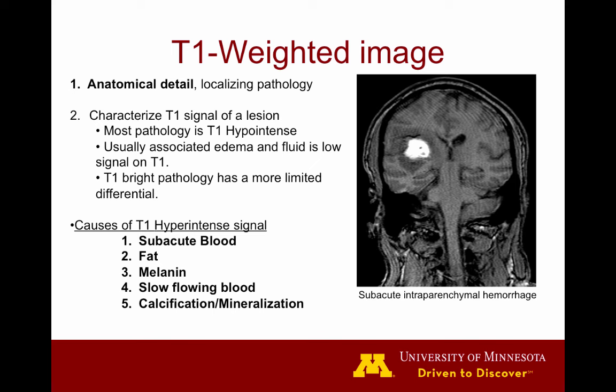However, there are a few things to take note of where disease processes cause increased signal on T1-weighted images, especially certain phases of blood products — especially the subacute phase. Fat-containing tumors such as lipomas, liposarcomas, dermoid tumors, and melanocytic tumors. Slowly flowing blood in blood vessels can lead to high signal, and even occluded blood vessels can show up as high signal on a T1-weighted image, and then certain forms of calcification and mineralization.